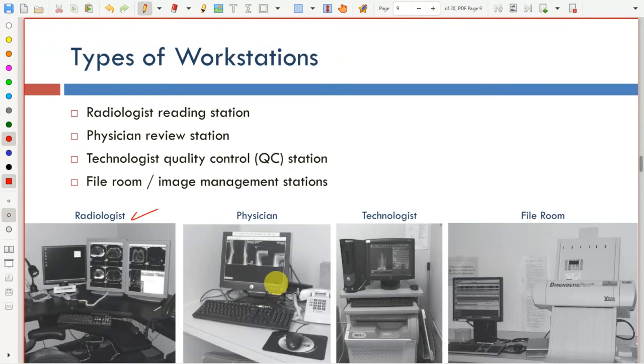Usually, for each physician, basically, if you're talking about the PACS system, it's installed somewhere in a hospital, and you have physicians, and these physicians are the ones who ordered the radiograph to be done in the first place. So basically, whenever the radiograph is taken, the images are sent back to the physician in order for him to complete his diagnosis. And basically, if he is going to assign a certain treatment to the patient, he can do that.